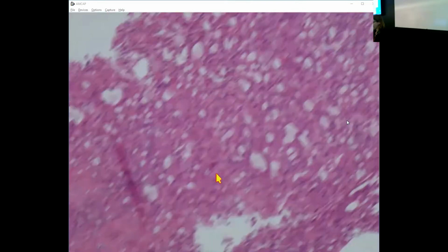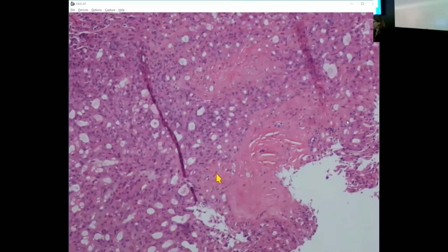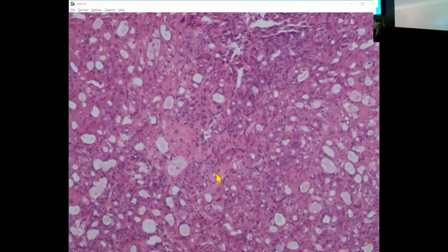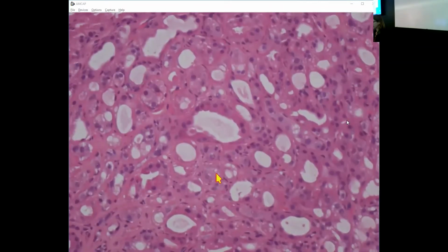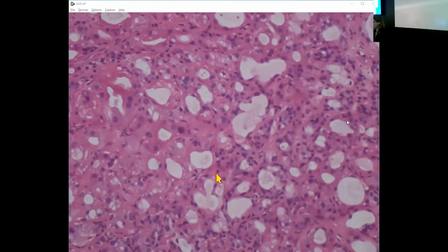And I have to say, I think I have a fairly low threshold in a core needle biopsy for atypical apocrine adenosis. I originally was thinking, well, it's not that atypical. And then I got a bit nervous. What do you think, Eddie? Do you think it's atypical? So I ended up calling this atypical apocrine adenosis.